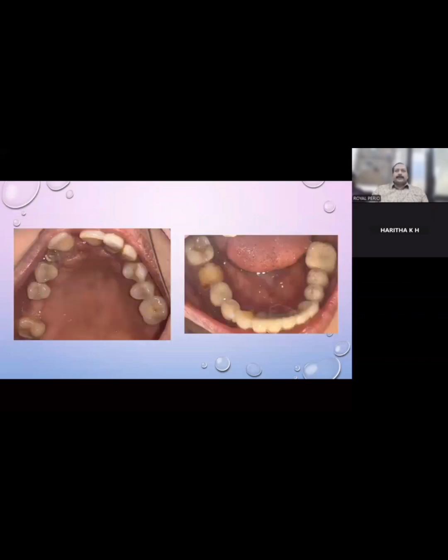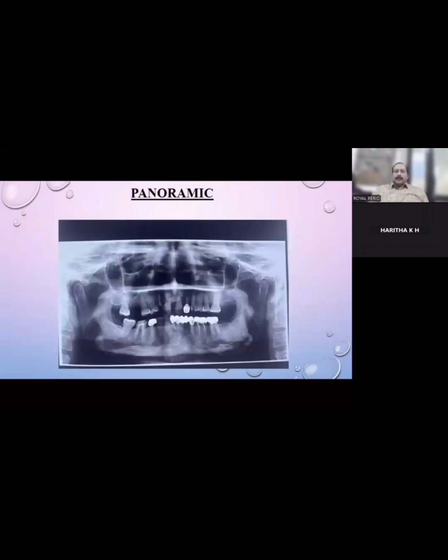Okay, X-ray. This is the occlusal view. That's the panoramic view. Can we read it from 1-7? That's 1-7, right? The last molar. How is 1-7? It's not mobile, it's firm. Okay. And the one tooth missing next to this is 1-6.